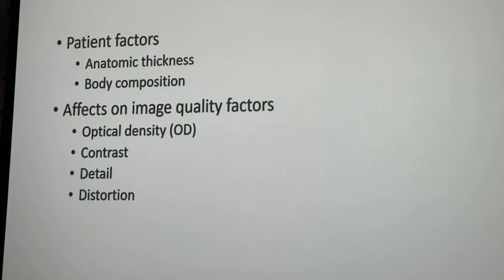Now what displays the contrast is your computer algorithm, that is your lookup table. So you make your exposure and you get a histogram based on the attenuation inside of the patient. It compares it to the lookup table that's stored into the computer.